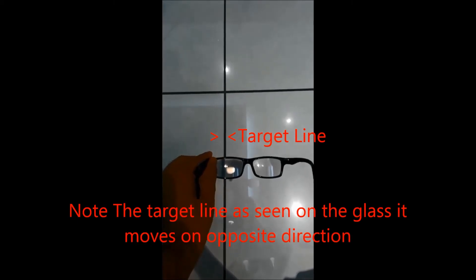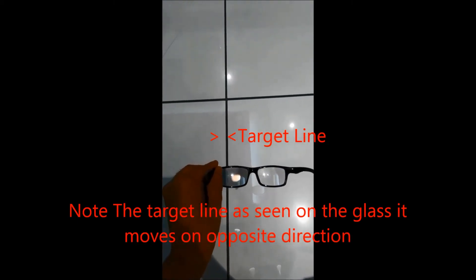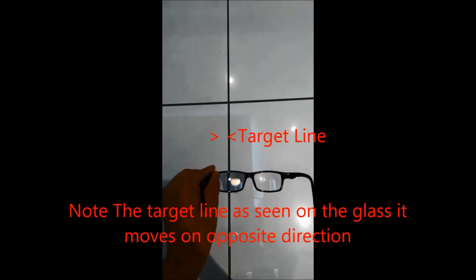On the other hand, with a farsighted glass, you can see that the reference point moves against the direction of your hands.